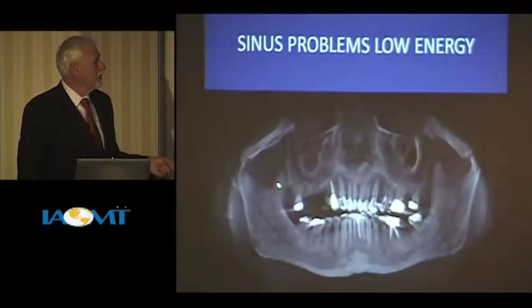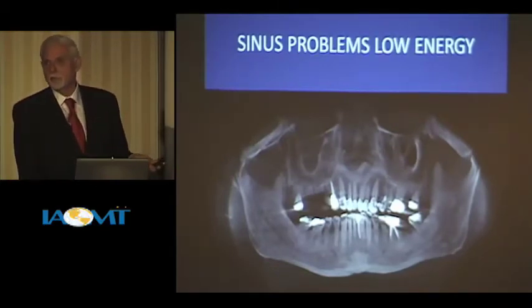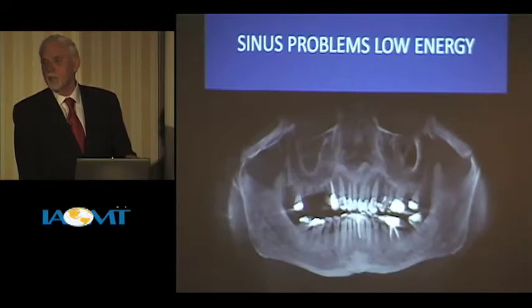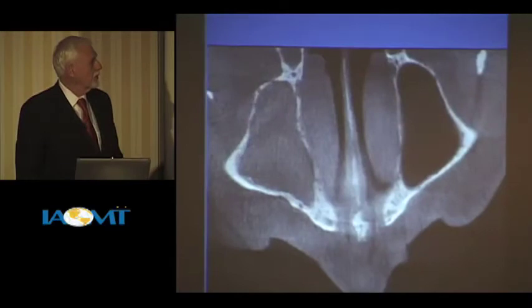All right, this patient, sinus problems, low energy, and some of these later ones I just pulled out, you know, within the last 3 or 4 weeks. I didn't have to go back and look for weeks and weeks to find examples to show you. They show up every day. This is on our left. This was his right sinus, totally occluded.